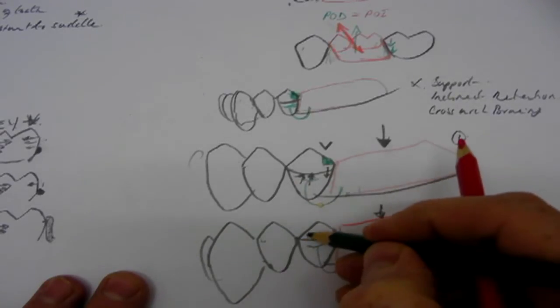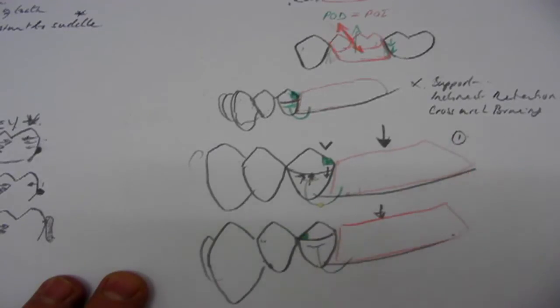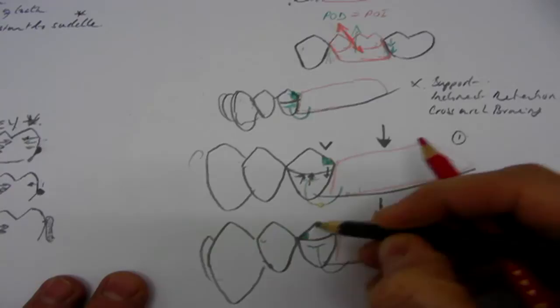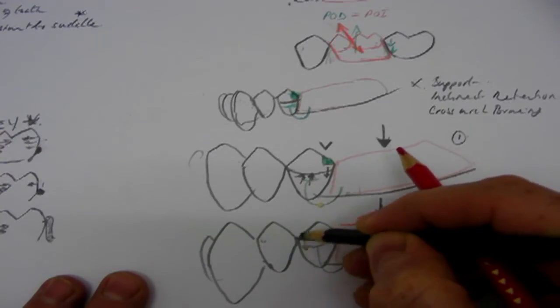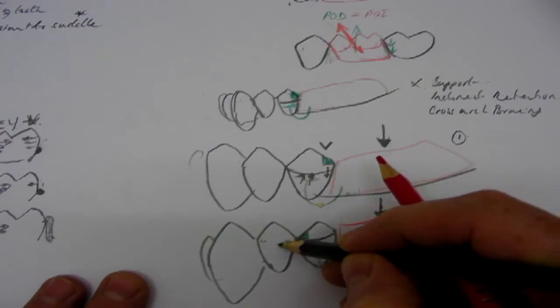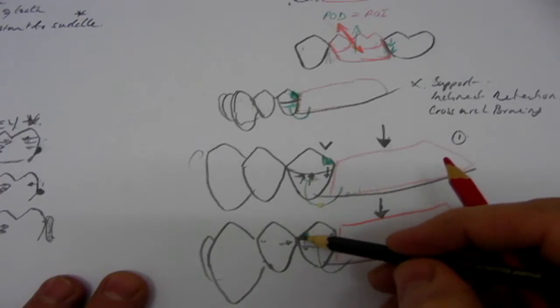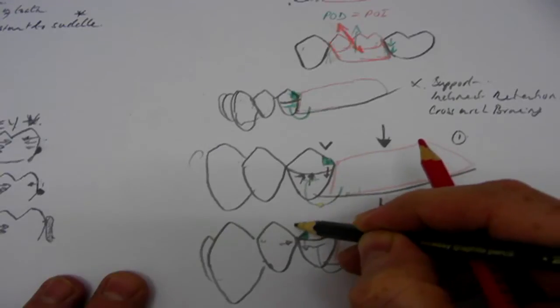But this time, if we put the occlusal rest on the mesial aspect of the tooth, what happens now is, as the load gets applied to the occlusal surfaces of the teeth, load may get transmitted down through the occlusal rest, but it's running down the mesial aspect of the tooth, and if anything that would try and tip the tooth forwards, and it can't be tipped forwards because it's got a tooth adjacent to it which is going to resist that forward movement.